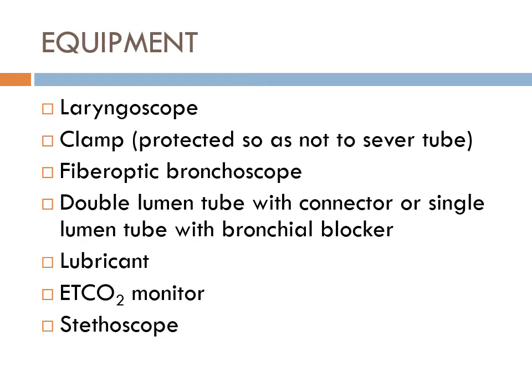I take my bronchoscope, I insert the bronchoscope through this extra port, and you'll watch on the camera, or if it's just a little eyepiece, you're watching until you see your cuff, and then you usually can see the Murphy eye right here, and then you pop out of the tube. Now you're looking at the anatomy of the lungs. We see the cartilaginous rings, we see the muscles, and now we're just watching it place this.